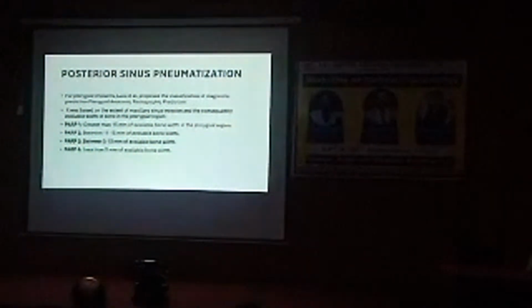Another very important parameter is posterior sinus pneumatization. This is the classification for pterygoid implants specifically. This is the pterygoid anatomic radiographic prediction given by Louis et al.